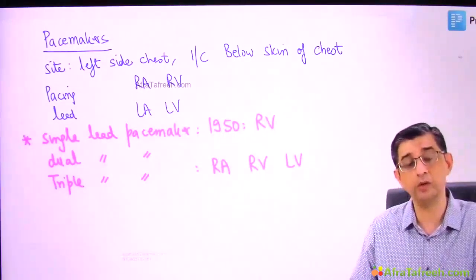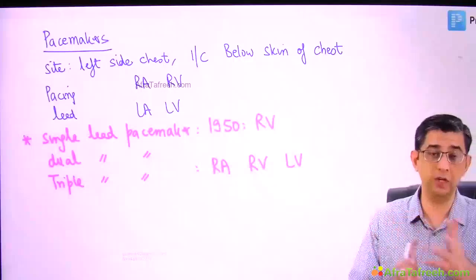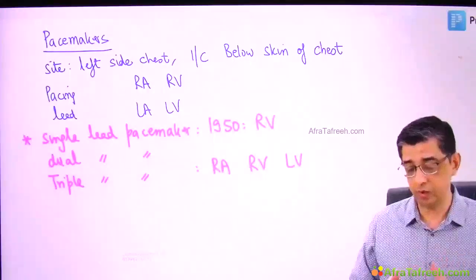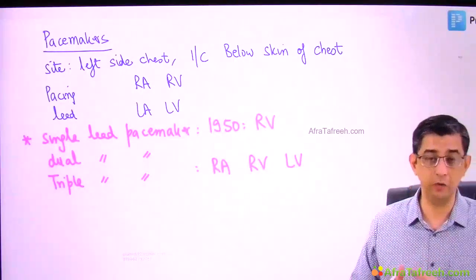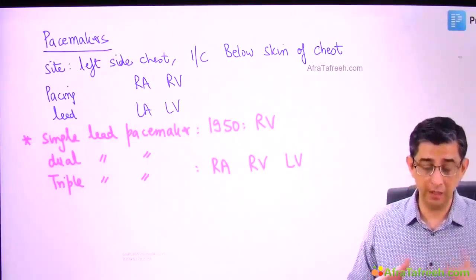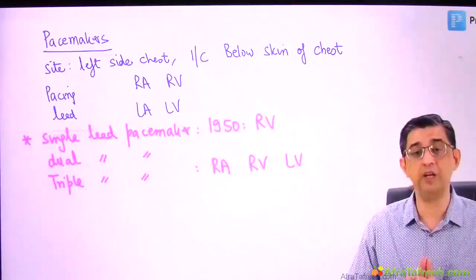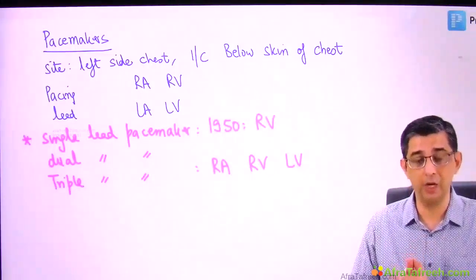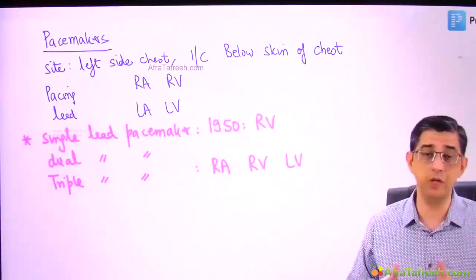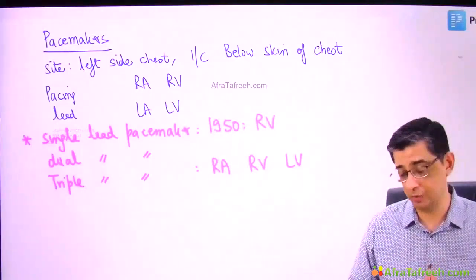On this, the query of most doctors is, well, why are you not trying to control the left atria? One, I want to say that if oxygenated blood comes in, the left atria will automatically be able to do its job. And second, the more control I try to achieve, I will obviously consume more battery. It will require a more sophisticated circuit as well. In a nutshell, the technology has been apt to ensure a proper firing of all these chambers at the right time. We are able to ensure proper blood goes to lungs for oxygenation, and once we time the left ventricular contraction or ejection, systemic circuit and cardiac output will definitely be obtained.